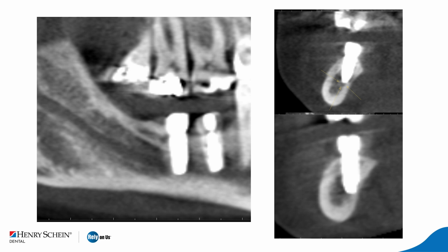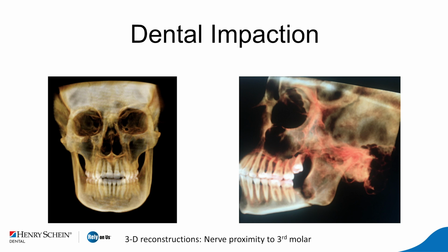So I always say, if you don't have a CBCT for your implant surgery, unfortunately, somebody else will have a 3D view of the area sooner or later, and you really don't want to be in that position. So that patient had numbness and paresthesia after the surgery. So that's not something that you want to happen. So always stay safe and take a CBCT when you're doing implants.